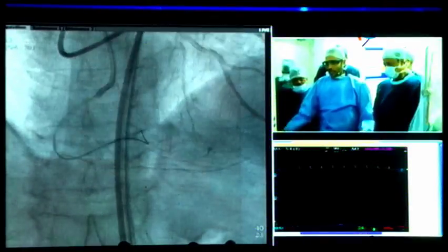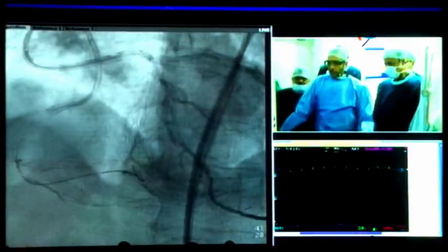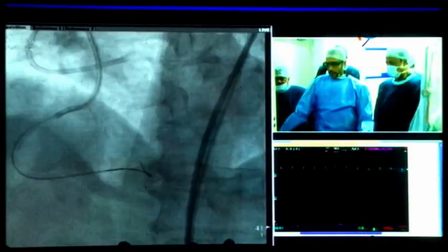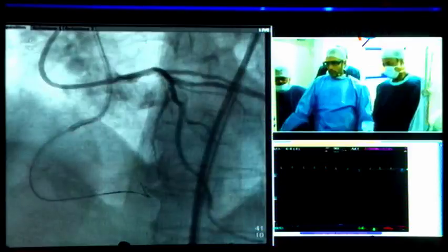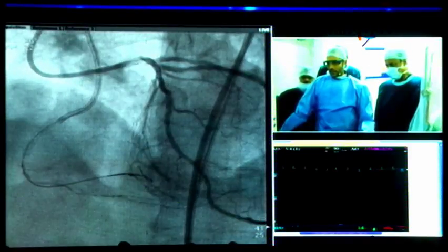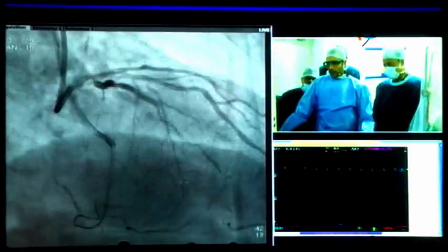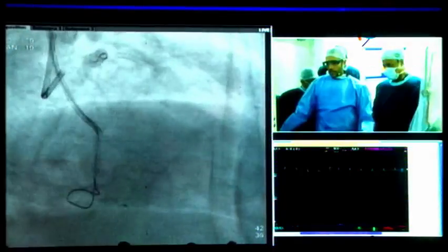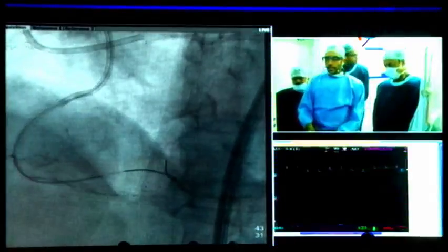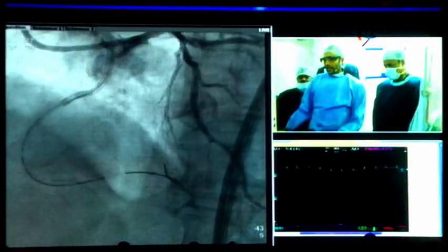So guys, again, feel free to comment. Next. Okay, go frame by frame so that the audience can see it. Next. Looks like it's going up a septal. We're down a branch and going up a septal. Next. Play it. Okay, next. So in this view, you can see that the PL goes up almost like there's a 120-degree bend there. And it looks like I'm going up a septal.